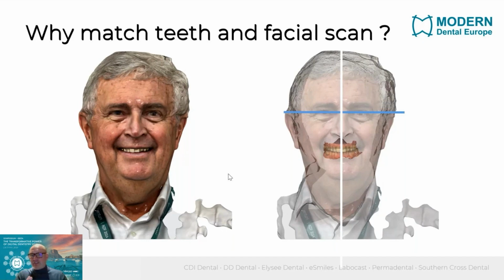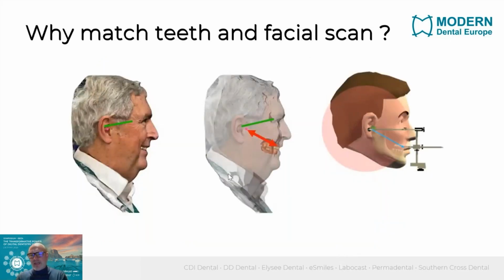So you can just send us the face scan, send us the intraoral scans, and we can merge them together in exocad to perform the smile design. So the assembly of what we have seen in the Rayface, the face scan and the various planes, we do in the lab in exocad.